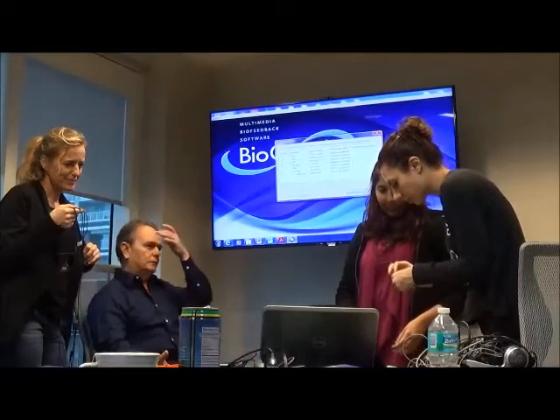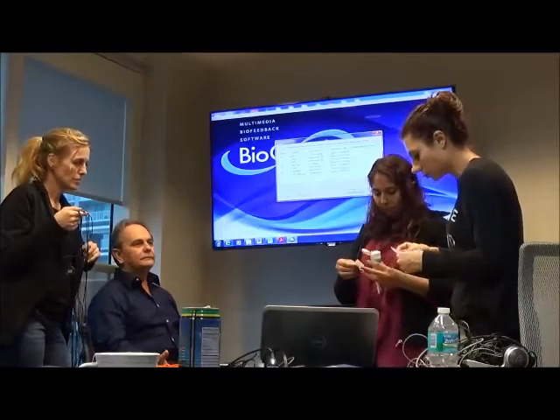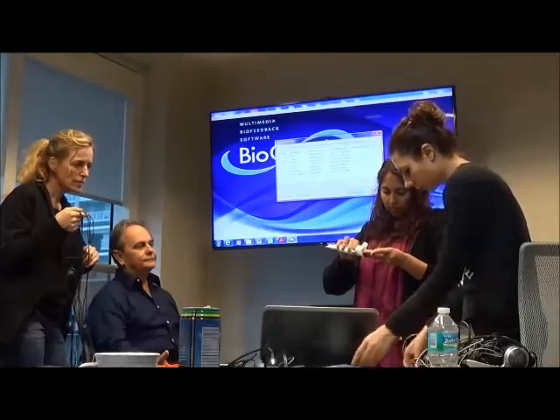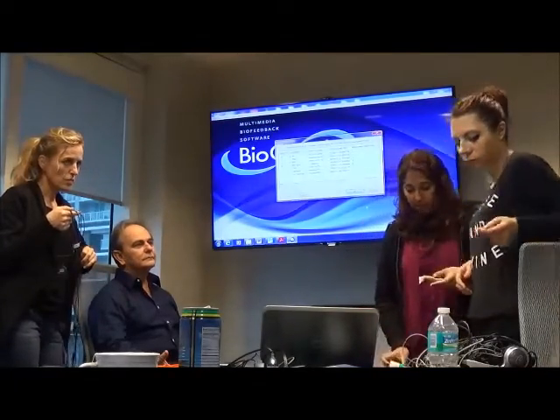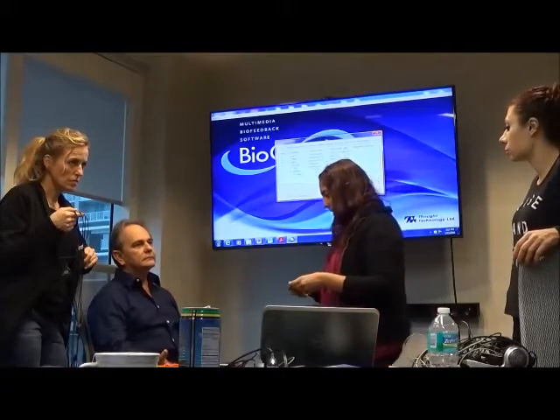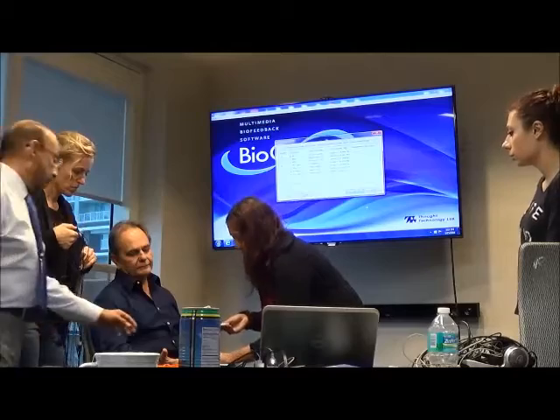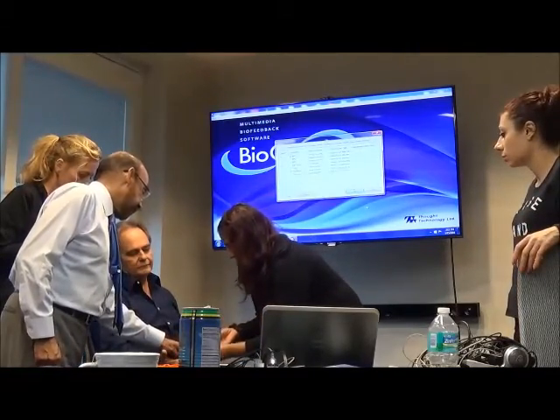Can we do the frontalis? Sure. Remember to rub. That's enough. Maybe we can just do one EMG. Can you rub on the frontalis, these two fingers? Here and here.